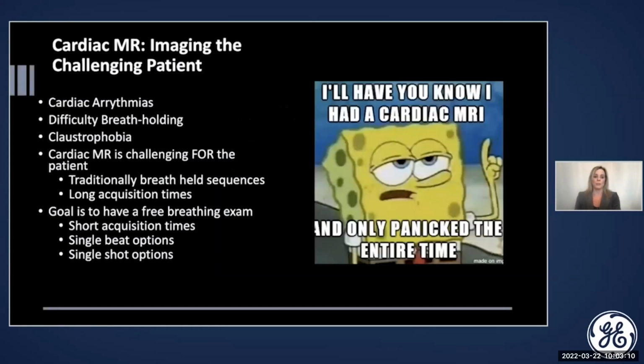When we think of challenging patients in cardiac MR, the first things that come to mind are cardiac arrhythmias, difficulty breath holding, and our claustrophobic patients. However, I think it's important to also realize that cardiac MR is very challenging for the patient. Our sequences traditionally have long acquisition times, and they require a lot of breath holding. So I believe our goal should really be a full free breathing exam where we have shorter acquisition times, and we're going to have to use single beat options and single shot imaging.